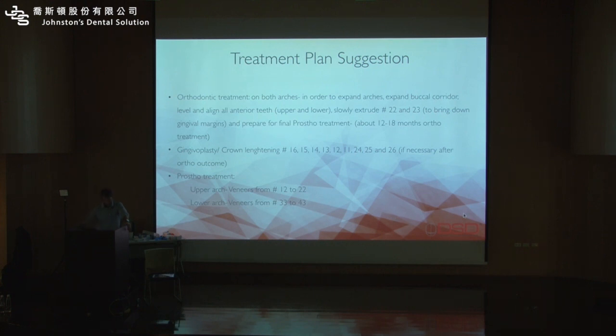So we are suggesting, of course this is a suggestion, the dentist is the one in charge. You need to use this as just additive information. You need to treatment plan the case. So from what we saw, of course we didn't do the clinical exam, we don't have his perio chart, there's many things that we don't have.